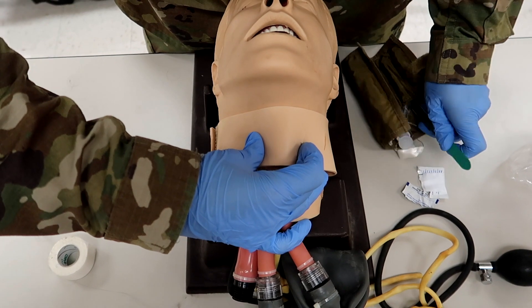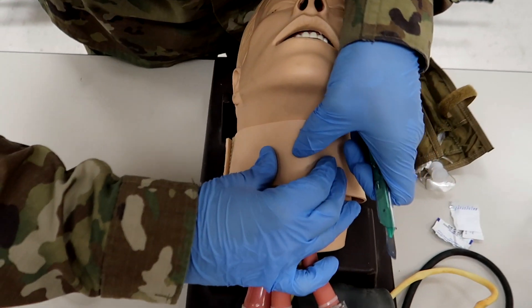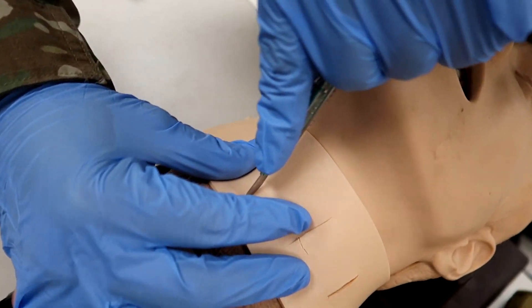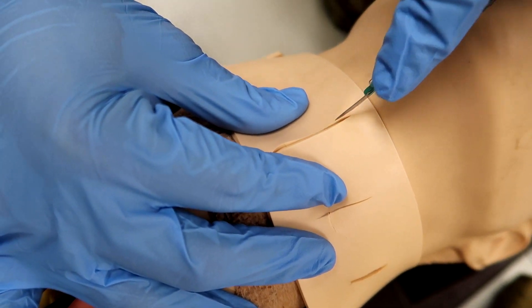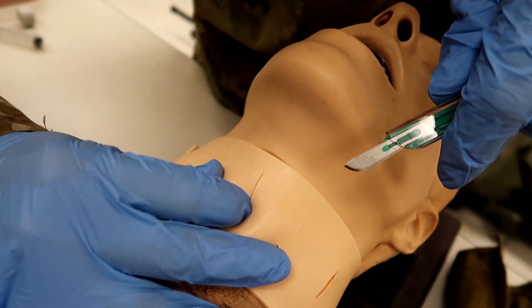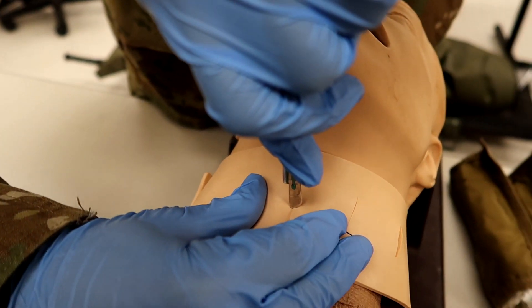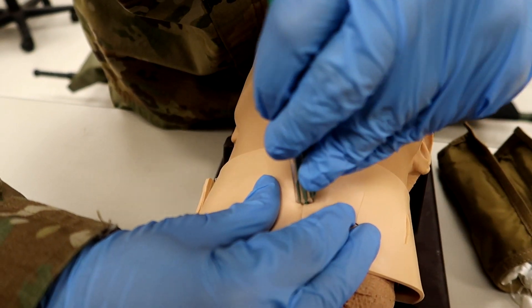Now that he's reconfirmed, he's going to turn the scalpel horizontally. He's going to make a one-inch vertical incision through the skin over the membrane. He's going in. Now that he's got his site there, he's going to reconfirm the site with his finger. He's located his site, and now he's going to turn the scalpel horizontally and poke through the actual cric membrane, making a half-inch incision.